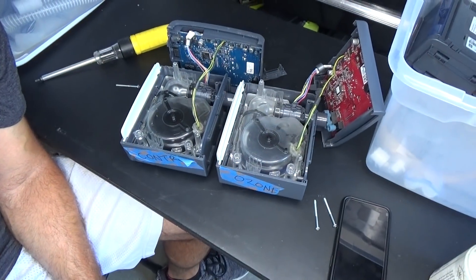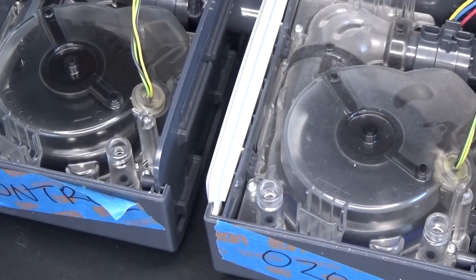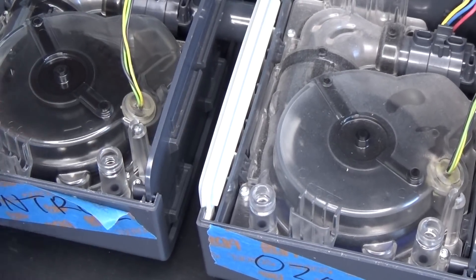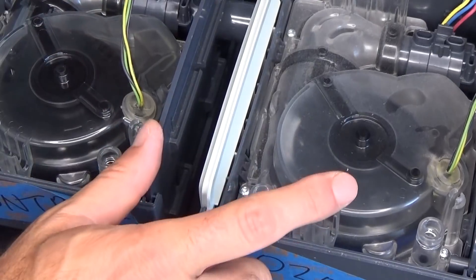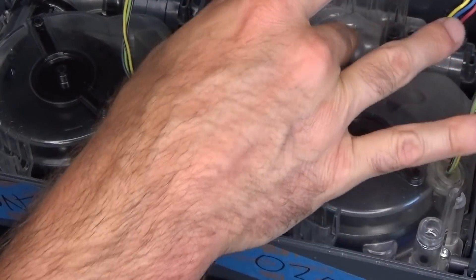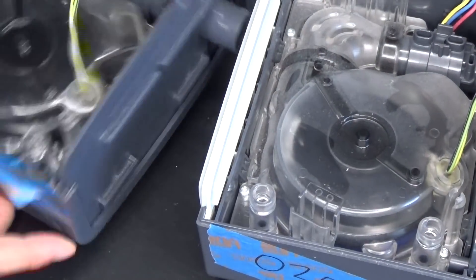I just pulled off the covers. Both of these units have been used about the exact same amount. This is the control — no ozone had ever gone through it. Look how clean this is on the inside. And look at how dirty this is on the inside of the ozone unit. There's dust everywhere on this one. Look how clean and shiny the control is.